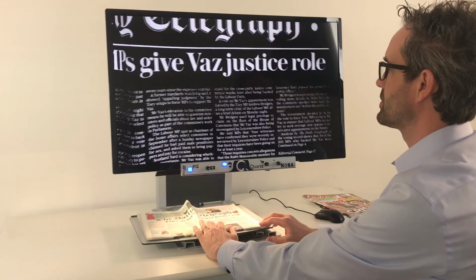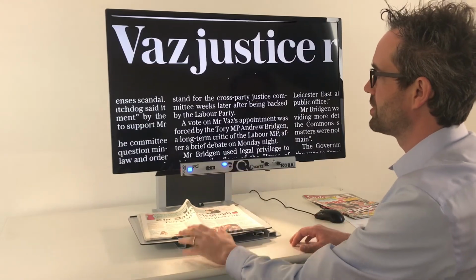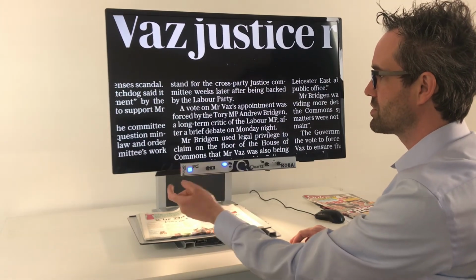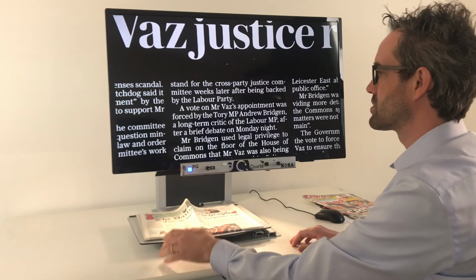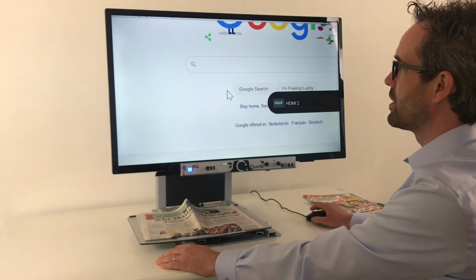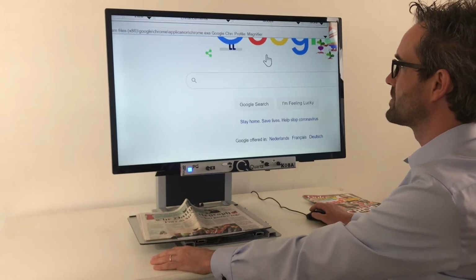So, okay. Then there is another button, zoom in, zoom out, right side, left side. This is for the computer connection. When I press it, you will notice that the screen will change to the computer. So you can connect the computer with an HDMI connection.